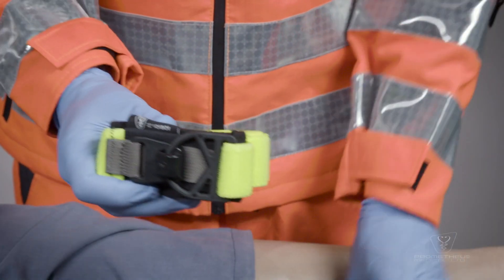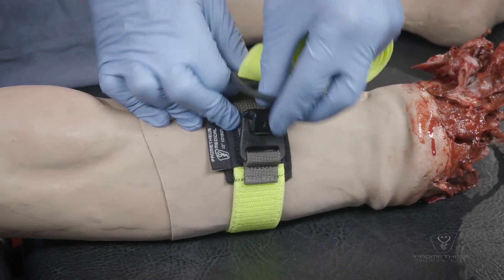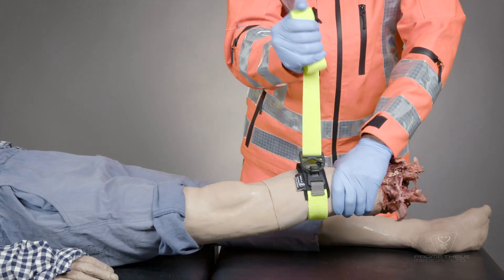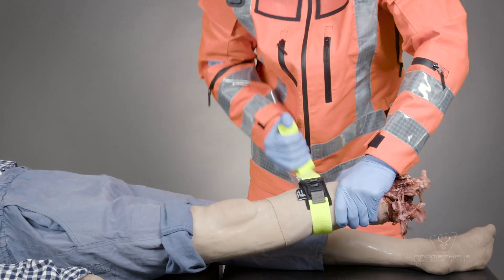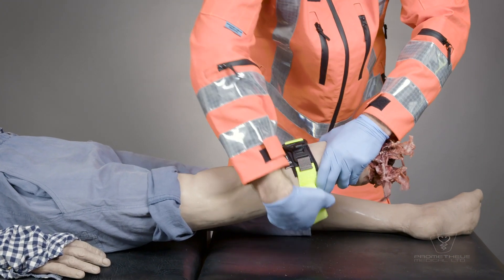Secure the Prometheus Full Stop around the limb at least five centimeters above the bleed site. Pull extremely tight and hold the stretch. Whilst maintaining extreme stretch, wrap as tightly as possible over previous layers.